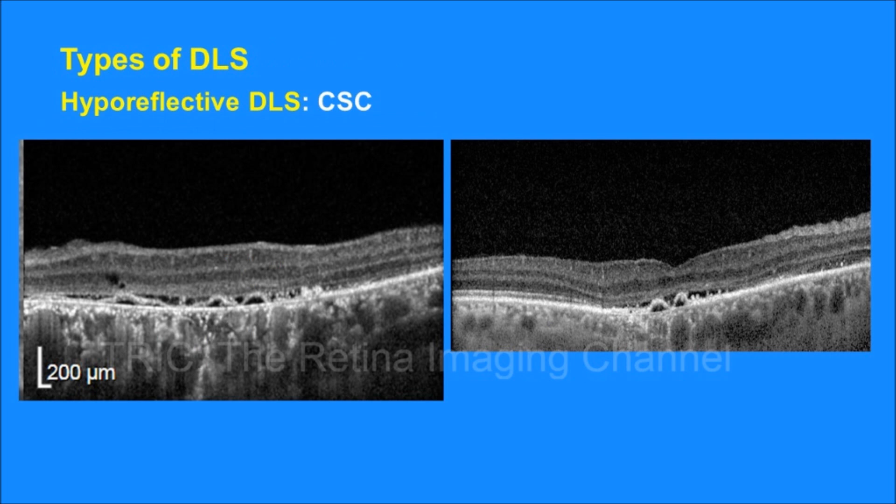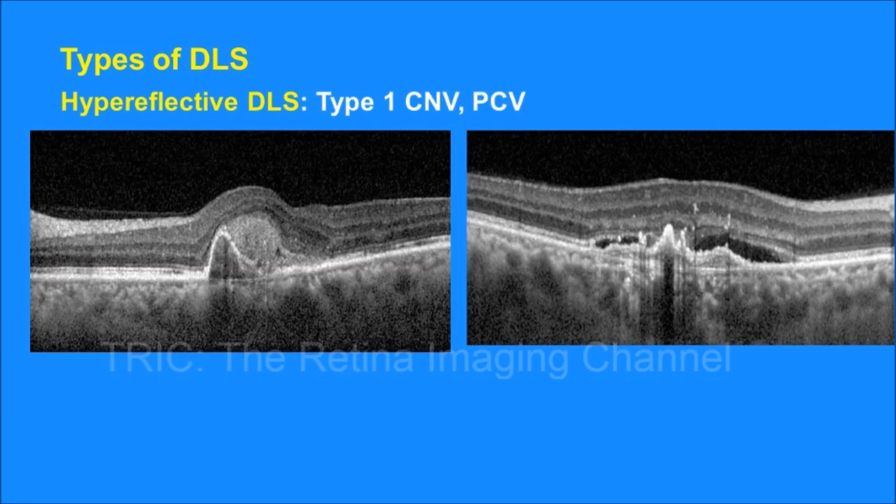Now are there any types of DLS? Yes. DLS can be hyporeflective or hyperreflective. The DLS seen in these two images is called hyporeflective because the space between elevated RPE and its basement membrane is clear or hyporeflective. Hyporeflective DLS is seen in central serous chorioretinopathy. In contrast, in these images we see that there is hyperreflectivity between elevated RPE and its basement membrane, hence this is called hyperreflective DLS. Hyperreflective DLS is a feature of type 1 CNVM or IPCV.